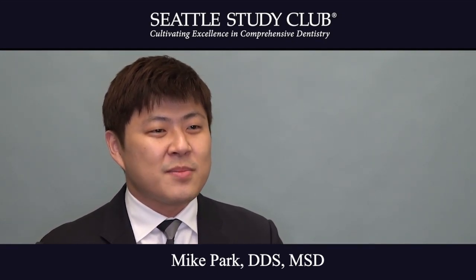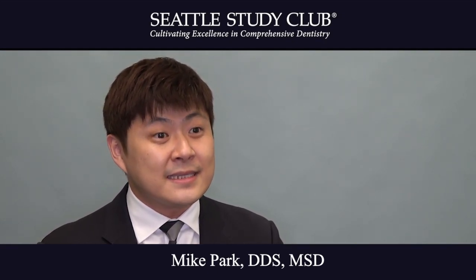My tip for you today is about digitally transferring the emergence profile of an implant-supported provisional restoration to the lab. One of the reasons why we do provisional restorations on implant is, of course, to replace missing teeth temporarily until the definitive restoration goes on. But the main reason why we do provisional restorations on implant is to shape and contour the peri-implant soft tissue.